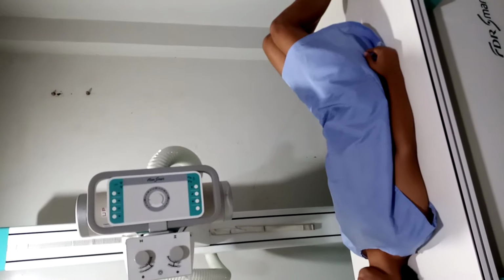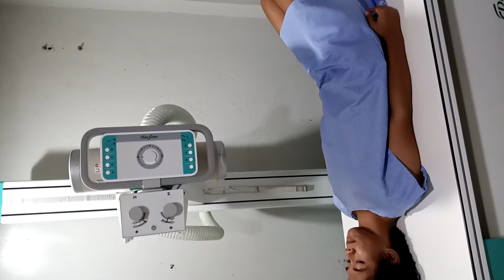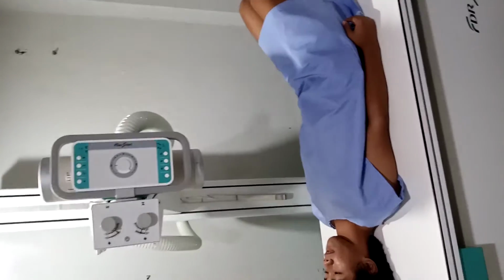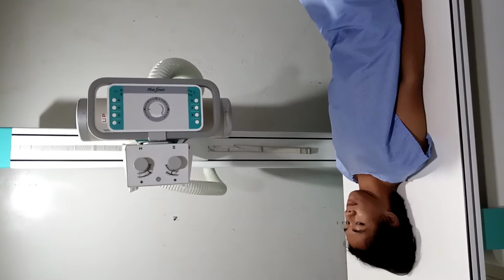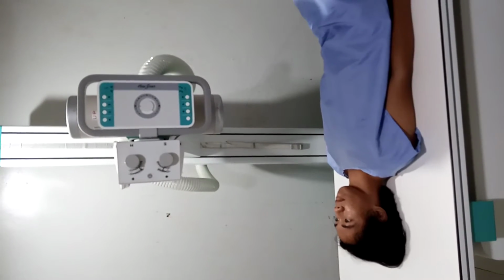Make sure that you always put in your mind to shield the gonads because the gonads of the patient are sensitive to radiation. Then, before exposing the patient, instruct the patient to suspend his breathing at the end of full expiration.